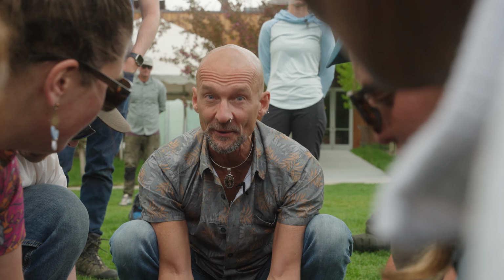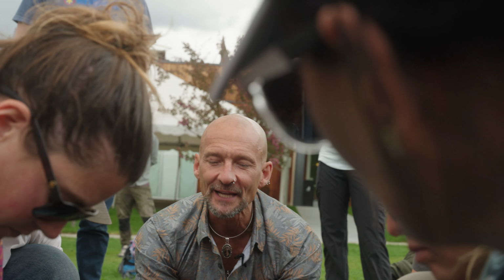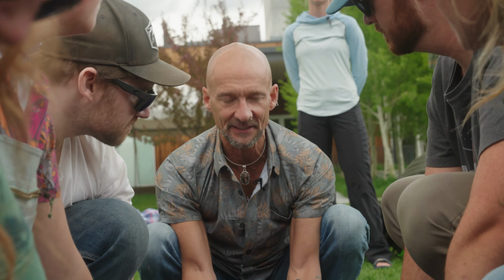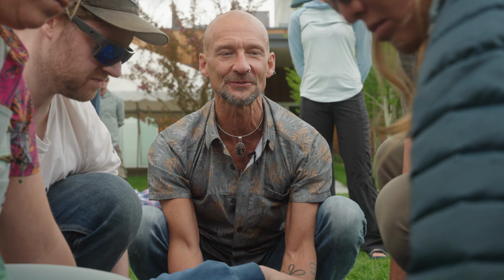So now when we pick up, what is important to recognize is that you folks are extremely strong compared to my movement. So I need you to move slowly, deliberately, and together, keeping the patient on a level platform and coming to a standing height with the patient, keeping them level, okay? Now, is anyone not ready? Excellent, all right? And you can see that you can get back into this position where you can now lock your back and you can get your knees over top of the patient even and get in close, which ultimately makes the patient lighter, okay? The closer you can get the weight to you, the less effort you will put into the process.